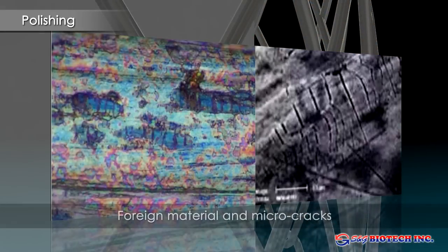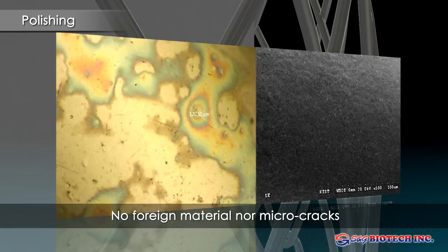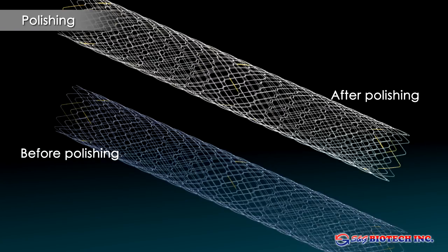Prior to polishing, surface residue and microcracks are evident on the metal. After the polishing procedure, the metal surface is smooth and clean, resulting in a stronger, more durable wire. The difference is evident by the change in color. Initially, the stent has a blue appearance, which changes to silver after polishing.